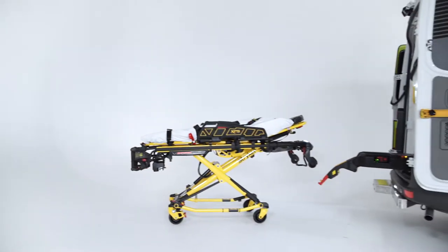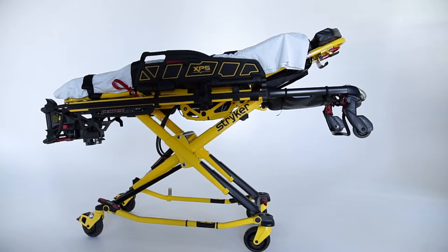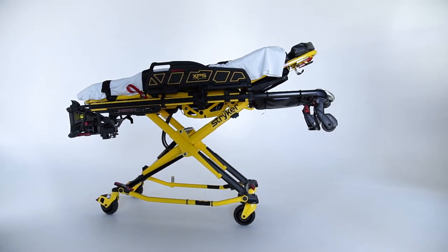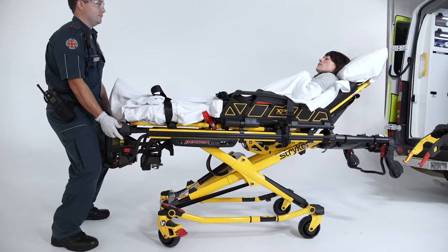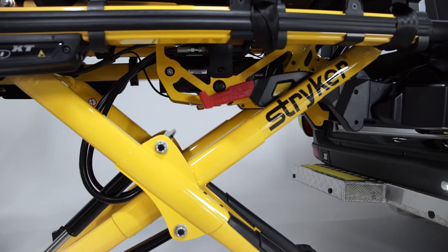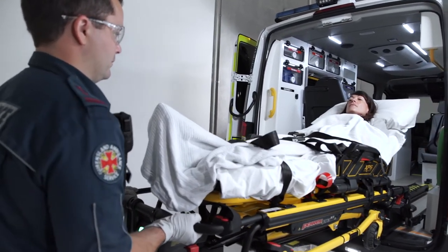Welcome. This program will guide you through the setup and operation of your Stryker PowerPro XT stretcher and PowerLoad stretcher lock and loading system. The PowerPro XT is a highly advanced battery-powered hydraulic stretcher that gives you power to serve your patients better and to save yourself from potential injuries.